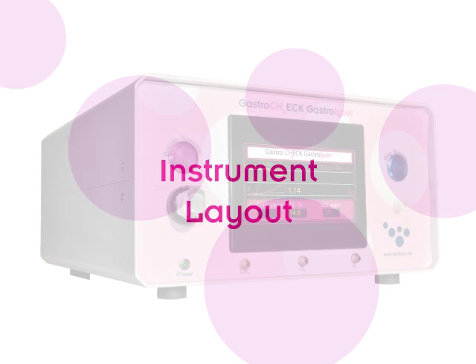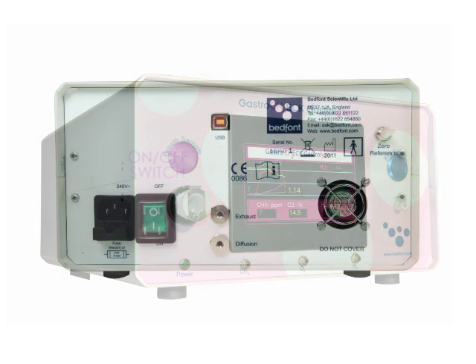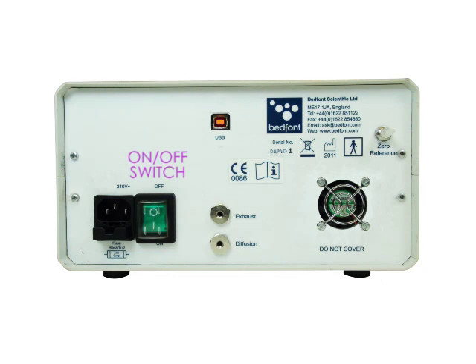Instrument layout: breath sample function button, sampling line dock, bag sample function button, bag sample connector, power on indicator, on-off switch, USB cable port.